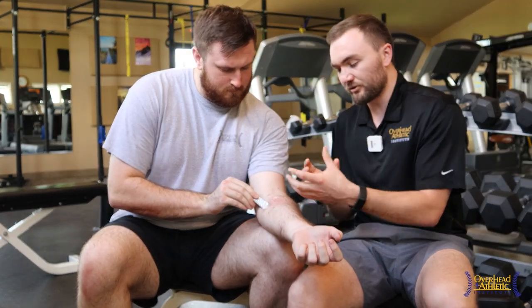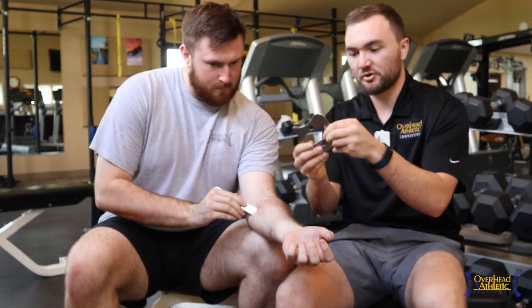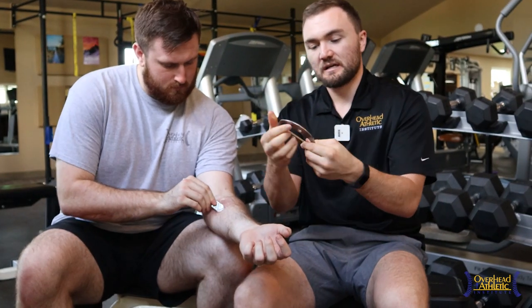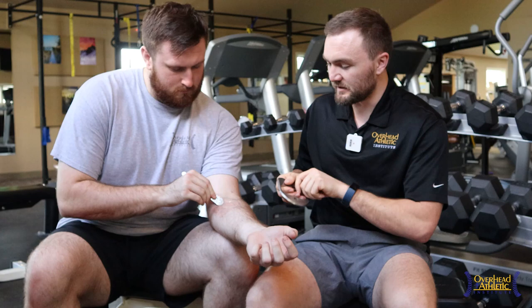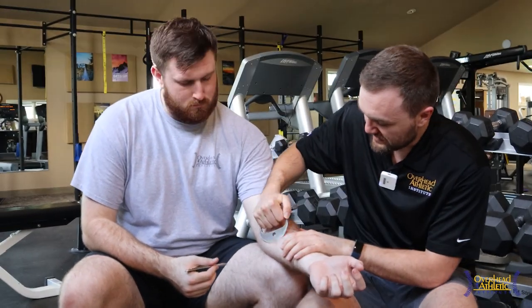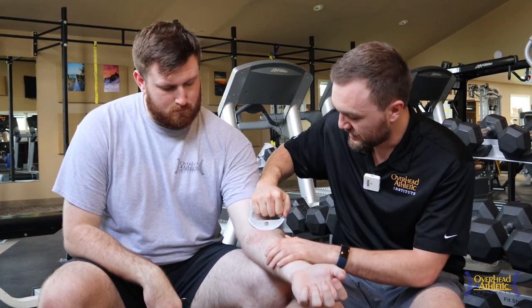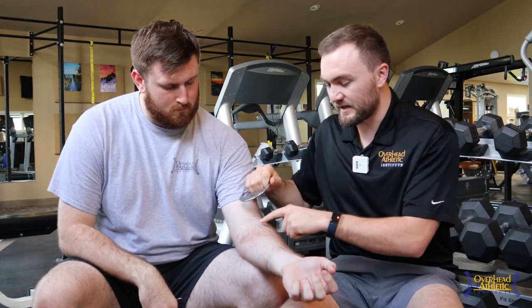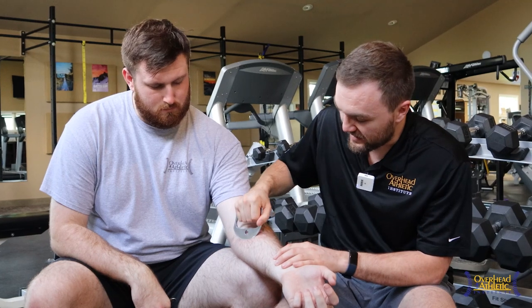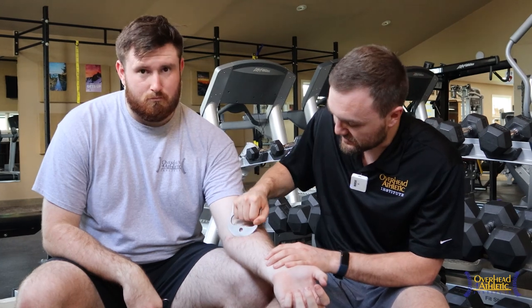Different tools are going to be effective for different techniques. A really common type of tool here has multiple different edges — some that come to a point, some that are a little more diffuse — and you can hold it and kind of get into some tissue. I do prefer the metal ones, and sometimes these ones that you can kind of grip work really well as they hit a large area. I'm not trying to cause bruising; I might get a little bit of redness of the skin. I'll go with the muscle fibers and then kind of perpendicular or across those muscles as well.